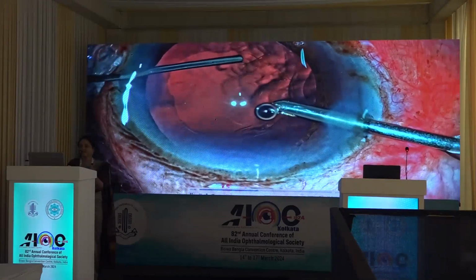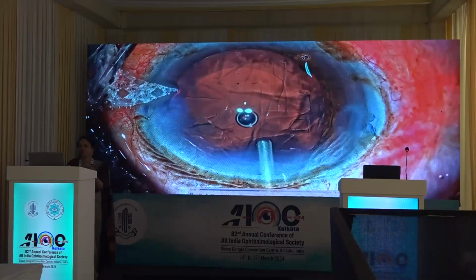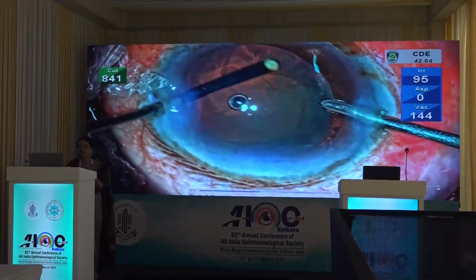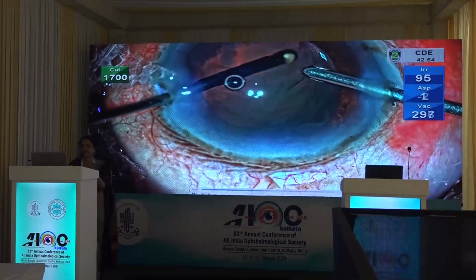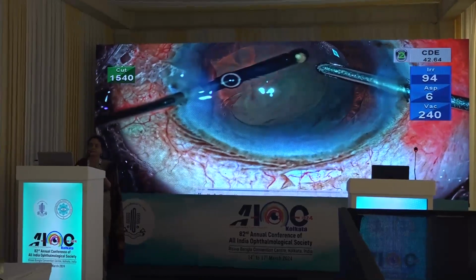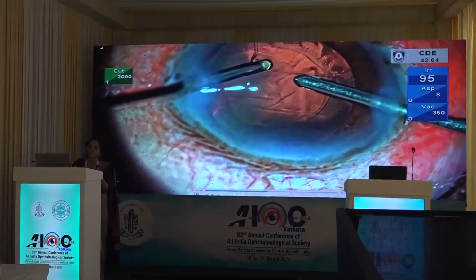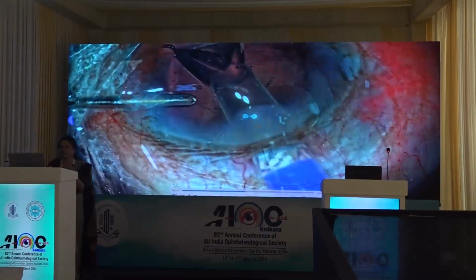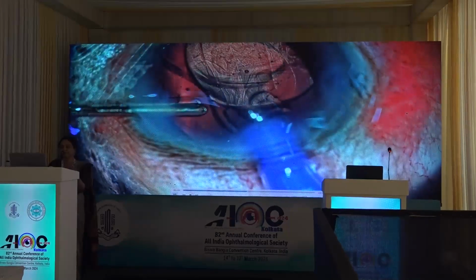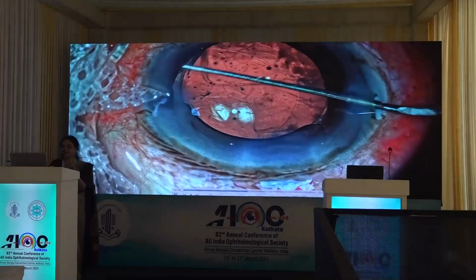So as we can see, there is a V-shaped tear running between 9 o'clock to around 7 o'clock. Be sure that the vitreous is not there in the anterior chamber or within the bag whenever you are implanting the IOL. This is usually done by confirming using intraoperative triamcinolone acetonide diluted 1:4. Now the chosen IOL is implanted in the bag.